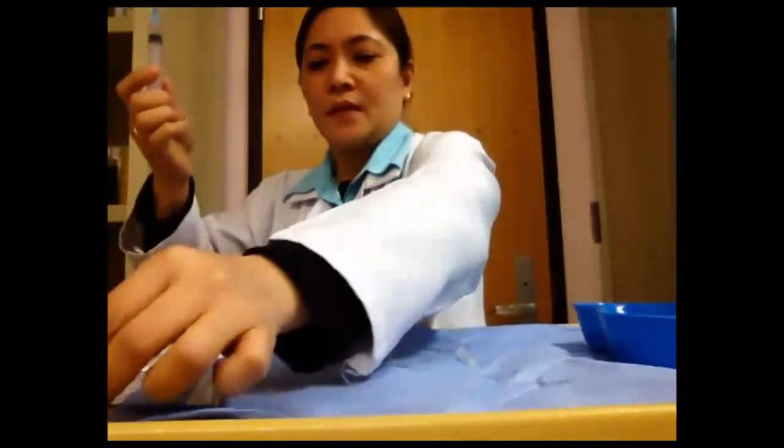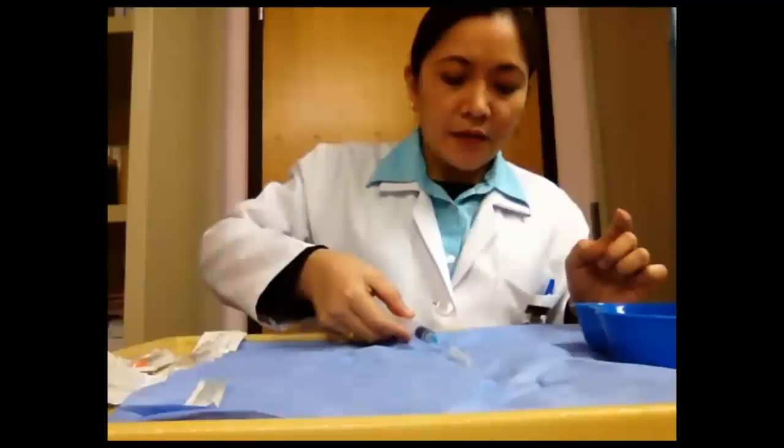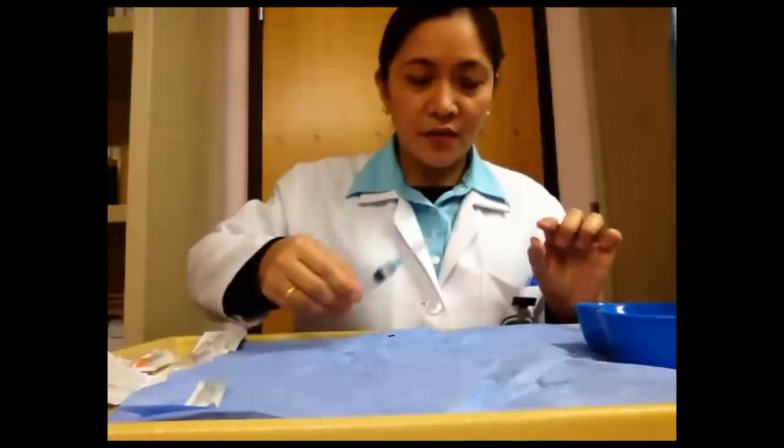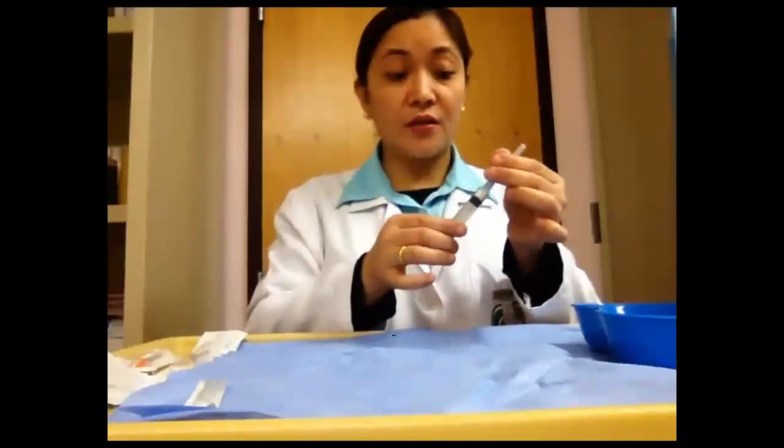Now, since we took the medication from the ampule, we don't have to recap in a scoop method, and it is not necessary to change the aspirating needle, because it is an ampule and we did not touch any side of it. We can use this one for injection.